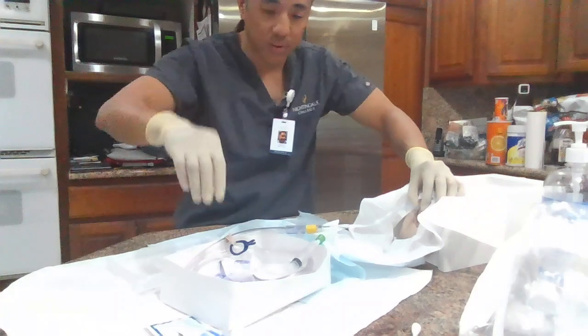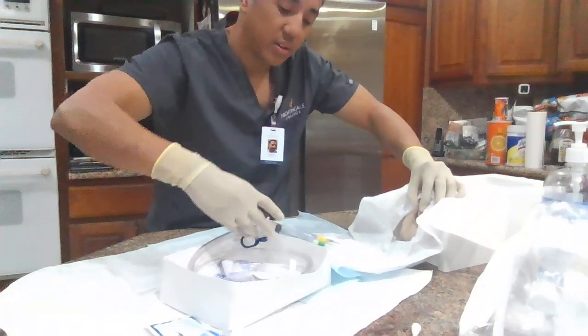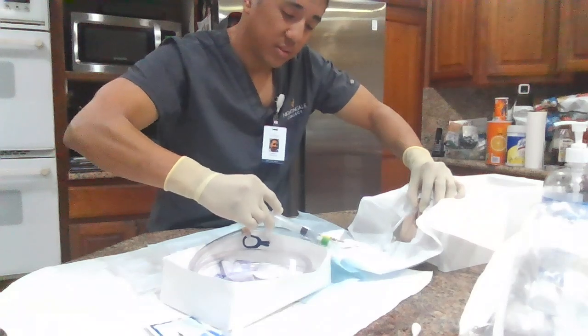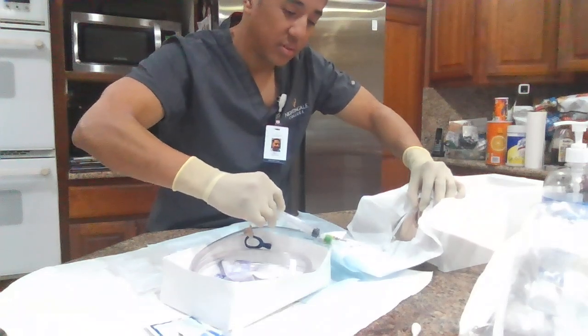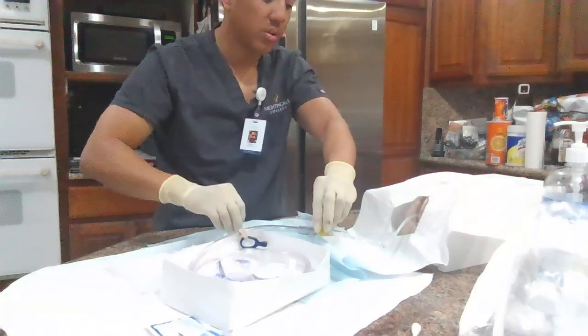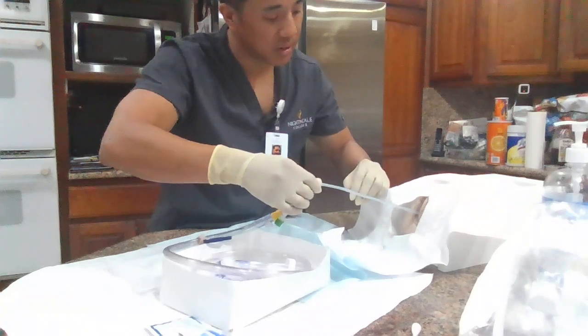Okay, I'm going to hold this. I'm going to take my clean hand and inflate the balloon. And then I'm going to take this out. Now I am going to pull back gently until I feel resistance.